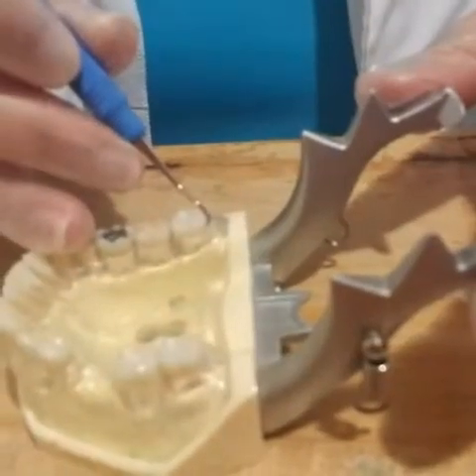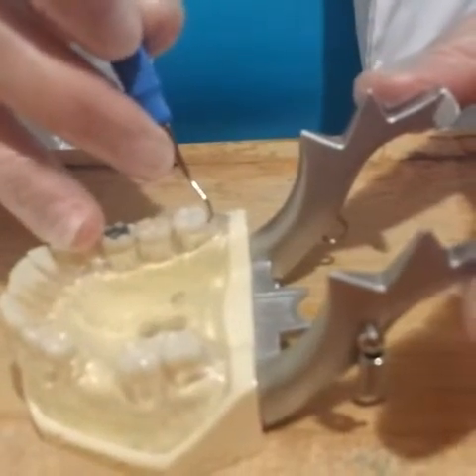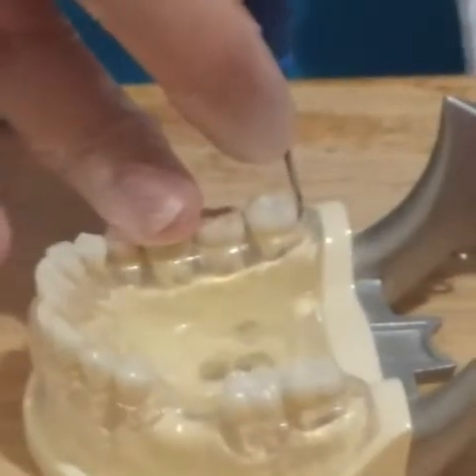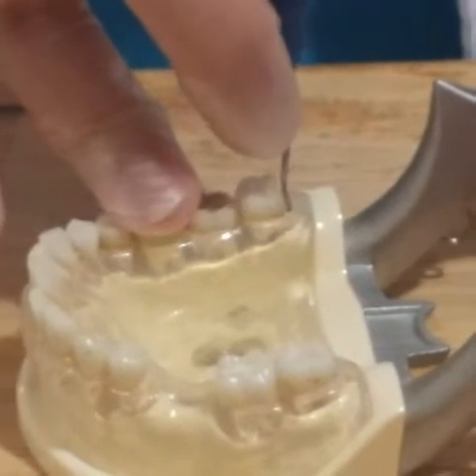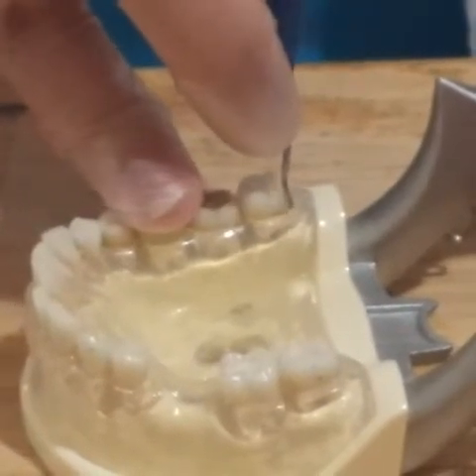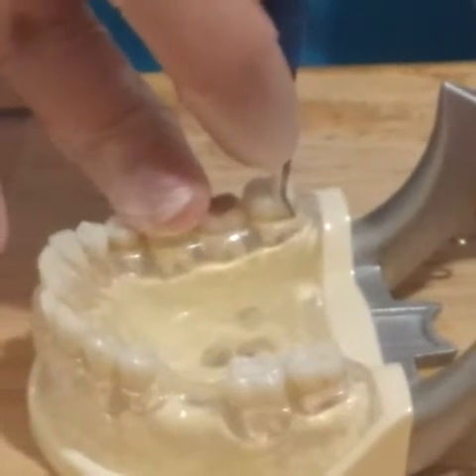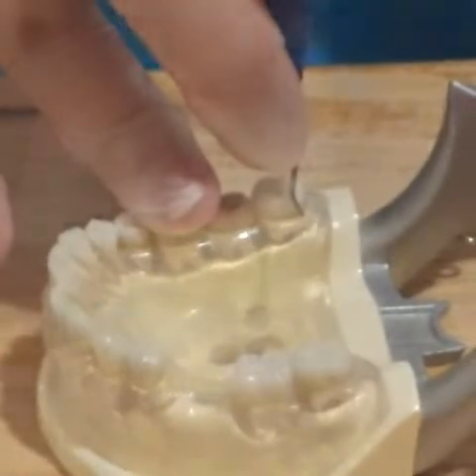Open the blade to tooth angulation to 70 degrees and use an assessment stroke. Continue this stroke distal until you reach the interproximal. Be sure to go slightly lingual to the direct distal to ensure that you cover the entire circumference of the tooth.